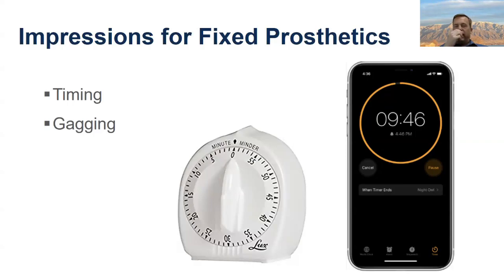One of the other tricks that I think would be really helpful is when you're syringing your material on the prep and the contacts, take a little bit of air and blow it down. A lot of people don't do that, and it just gets you so much better adaptation. I think you'll find that that little bit of impression material that goes past the margins, when you start using that blowdown technique, you'll see that all the time. And it really, again, helps us in the laboratory because we're like, okay, there's the margin. So we can see that clear margin and get you a much better fit.